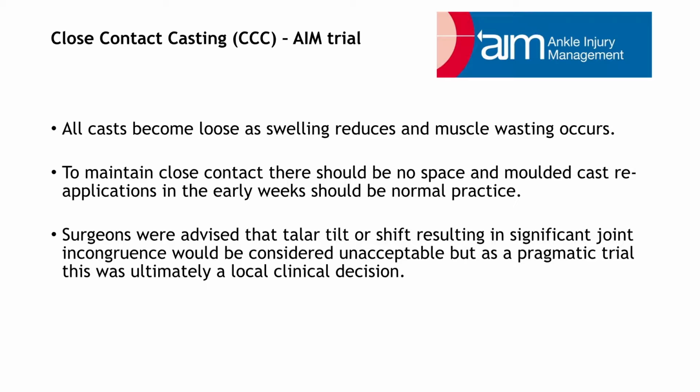We expect the cast to start loosening as swelling reduces and muscle wasting occurs. To maintain close contact, there should be no space, and therefore moulded cast reapplication in the early weeks should be normal practice and anticipated. Recasting needs to be conducted at the earliest signs of loosening.